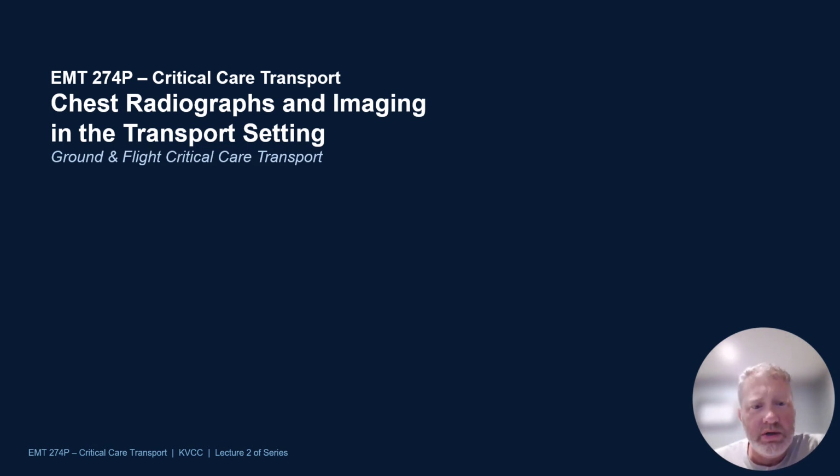Lecture 2 for this week deals with chest radiographs and other imaging in the transport setting.